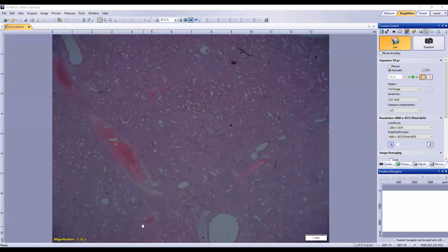So ordinarily, do we have macrophages within the alveoli? Sometimes it can spill over. Yeah, exactly. So what we'd be looking for within the lumen here is not so much whether or not they're there, but how many and what sort of state they're in, whether they're hypertrophic and phagocytosing material or whether they're just kind of bystanders and it's primarily a neutrophilic process.